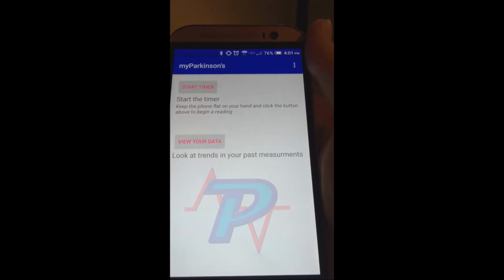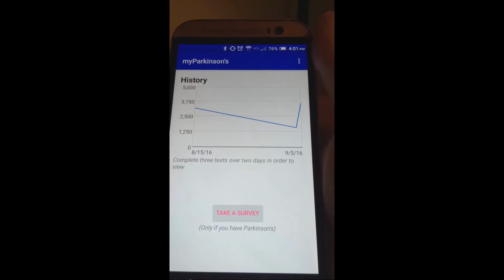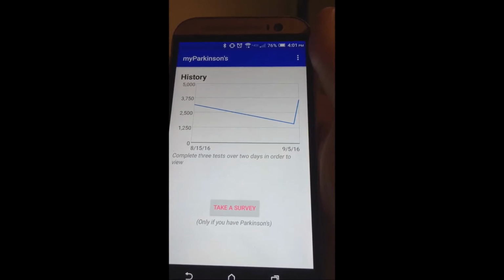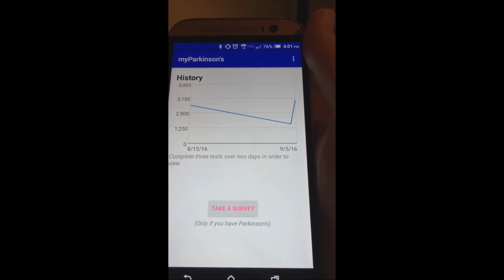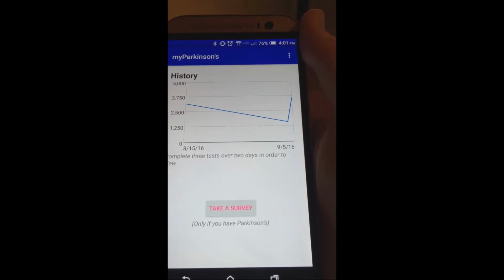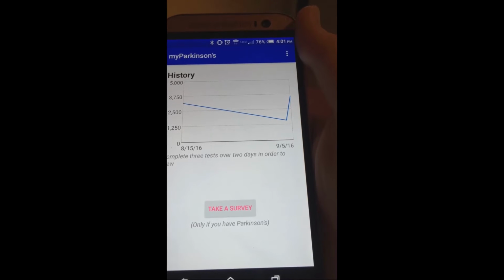I can take all the data from the database and use it in research to discover more about the nature of the Parkinson's tremor and how it progresses over time. I believe crowdsourced research is an untapped goldmine. We all have little research devices in our pockets opening up the doors to a gigantic sample size, which means more accurate data. On the technical side, the information is already stored in JSON, JavaScript object notation, so the data can be easily read by a computer, and I can even apply machine learning pattern recognition algorithms to the measurements.